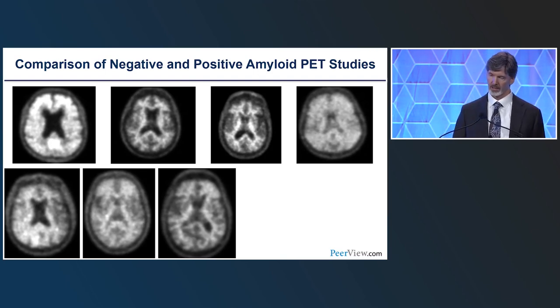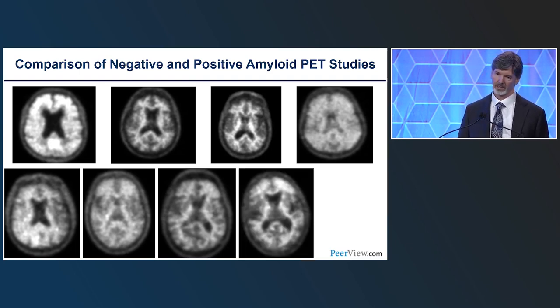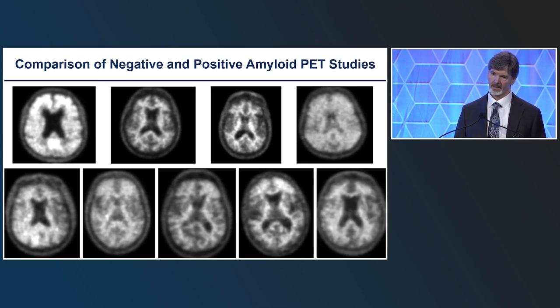As shown, these are all pathologically proven amyloid positive cases. What about this? Not so much in the back, in the occipital lobe and posterior temporal lobes, but frontally this person's got some amyloid. How about this?